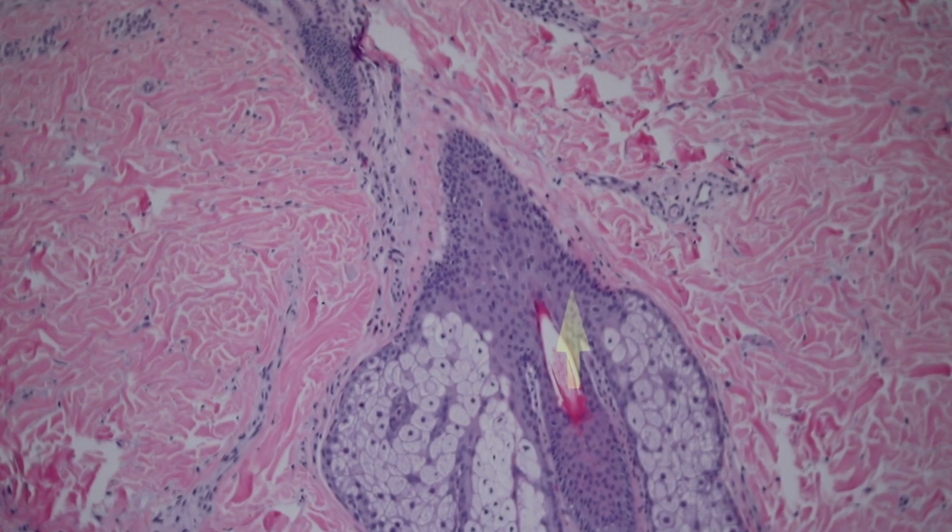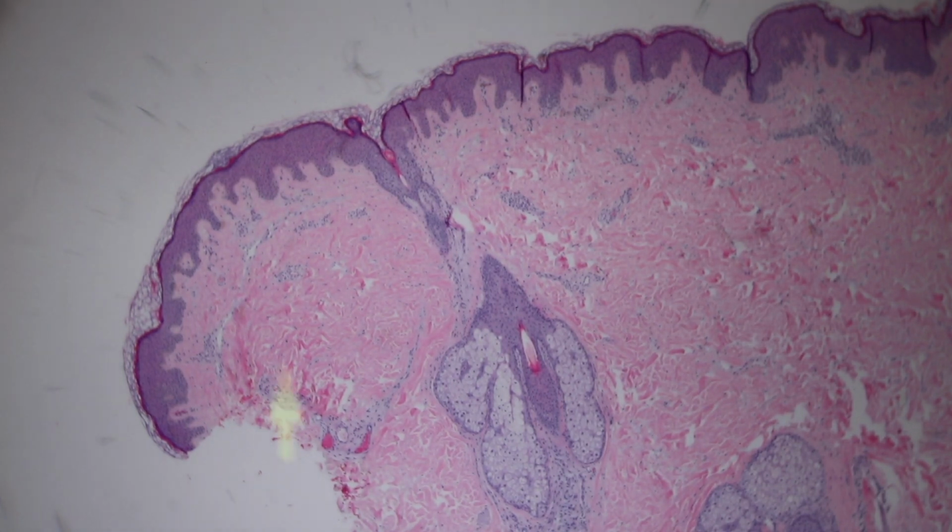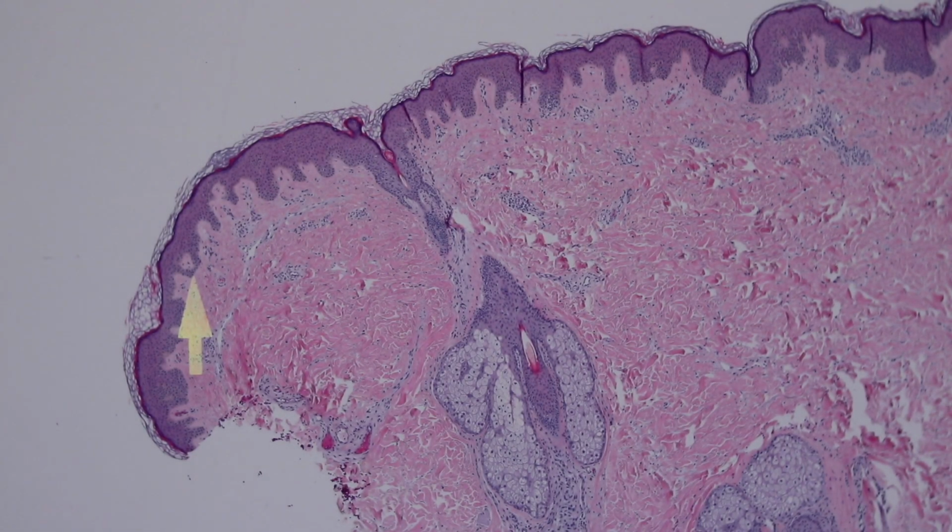Over here you can see, this is nice. So here is a hair follicle. Let's go to lower power. And you can see that this is a follicle, but it doesn't look like it connects to the surface. And that's one thing that's a little bit hard for some people to learn about pathology, is you have to think a little bit. We're looking at a two-dimensional slice of three-dimensional tissue. So that follicle definitely connects up to the surface. You can kind of see the top of it up here. It just kind of is out of the plane that we've sliced through. So if you sliced a little deeper, you might see where it actually starts to connect up to the top there.